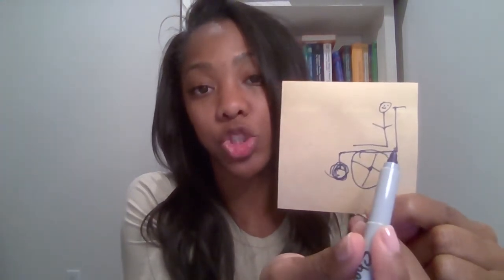So if I take the weight off of the casters and put the majority of the weight behind the drive wheel, or posterior to the chair, now I can pop a wheelie, I can go up curbs, right? And I can zip around. So my chair is very maneuverable, but it is tippier. So there's an advantage and a disadvantage.